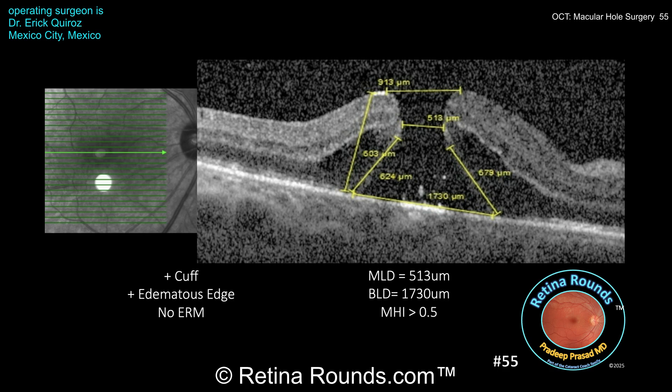We can also look at a quantitative measure called the macular hole index, or MHI. There are multiple indices for macular hole prognostication, but an MHI greater than 0.5 can indicate both a higher likelihood of closure and vision improvement. The macular hole index is calculated as the ratio of the height of the macular hole to the base linear diameter, or BLD — the width at the base of the macular hole at the level of the RPE. In this case, the BLD is measured at 1,730 microns, and the ratio of height to base is greater than 0.5.